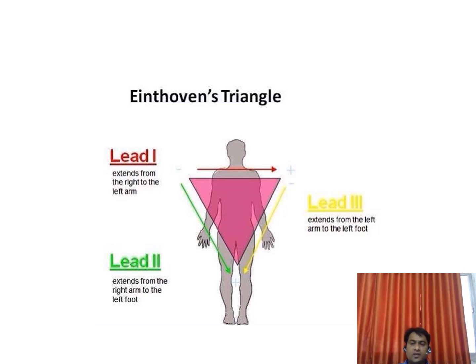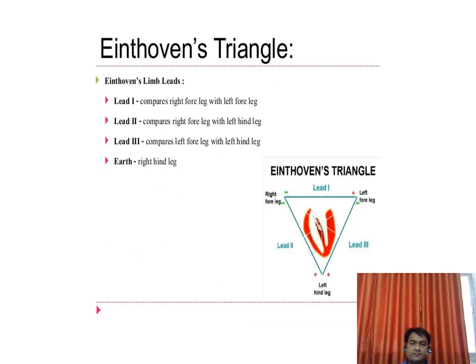Left arm to the left foot. Okay. Lead 1 extends from the right arm to the left arm. Lead 2 extends from the right arm to the left foot. Lead 3 extends from the left arm to the left foot.